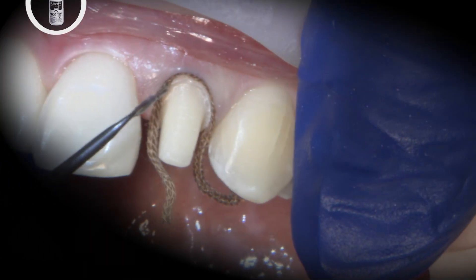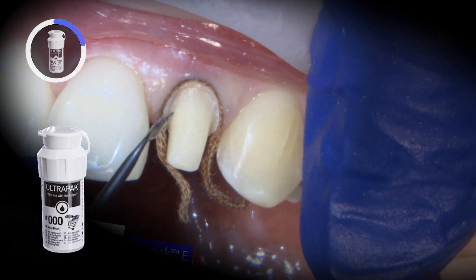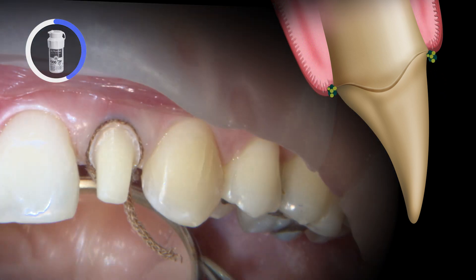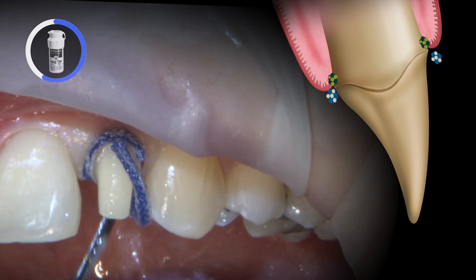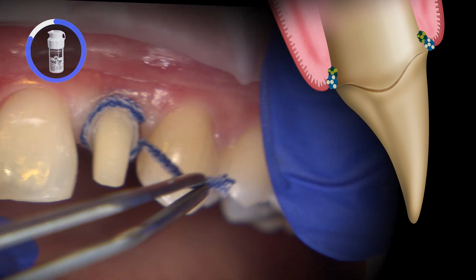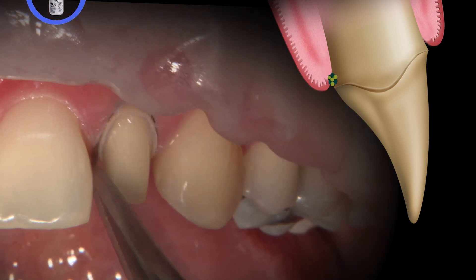For soft tissue control, a two-cord retraction technique is utilized prior to the digital final scan. Using UltraDense UltraPak cord, the first cord, size 00, is for apical compression without Hemadent. The second cord, size 1, previously soaked with Hemadent, is for lateral deflection. After 5 minutes of compression, the first cord is typically left in the sulcus and the second cord is removed prior to scanning.